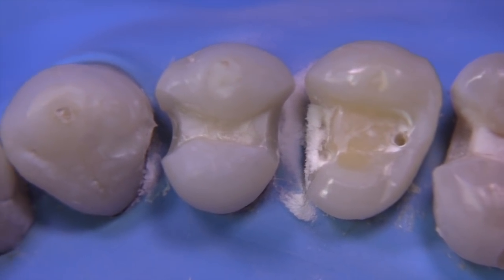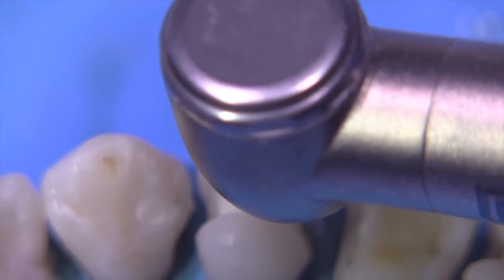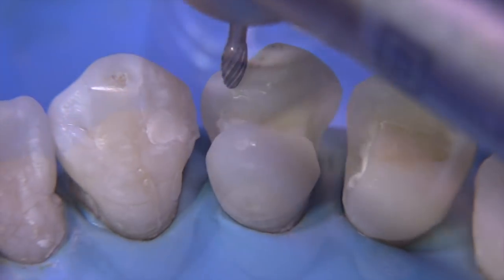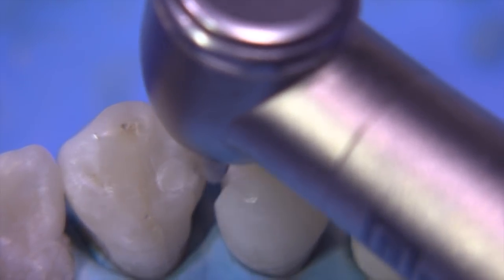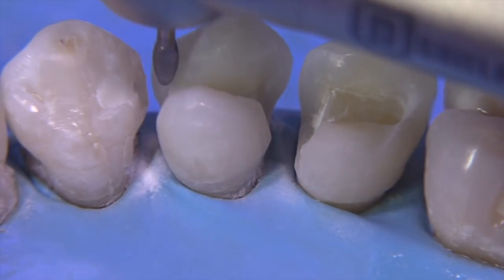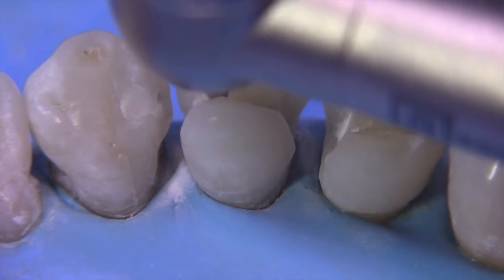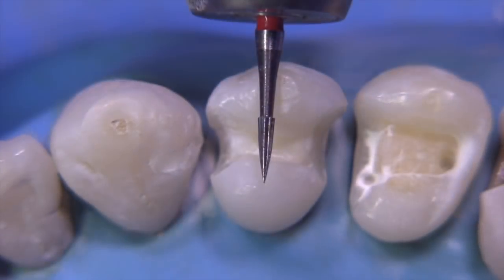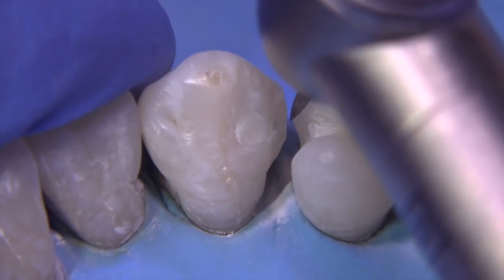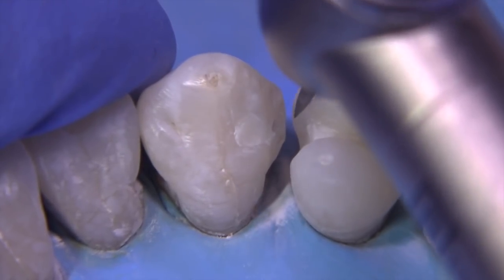These hollow grinds are okay, but they're a little bit thin at the gingival, and we want to give a little more bulk so the gold will cast better. The 7404 is really the workhorse of the hollow grind. It's hard to get interproximal initially, so that's why we used the 7102 at first. Now you can see we're getting a little bit more bulk — probably about a millimeter axial depth at those interproximal areas. You can also run this along the occlusal and take advantage of the natural taper of the burr to create the proper draw and to finish the enamel margins. A little bit of a bevel is a good thing to do — not a flat bevel, but more of a steep one. And sometimes I'll use the 7901 in really difficult access areas, like out here on the mesial facial, just to get the tip of that through there to remove any loose undermined enamel. But this is not really the right burr to use to create the hollow grind; it's more just to finish the margins.